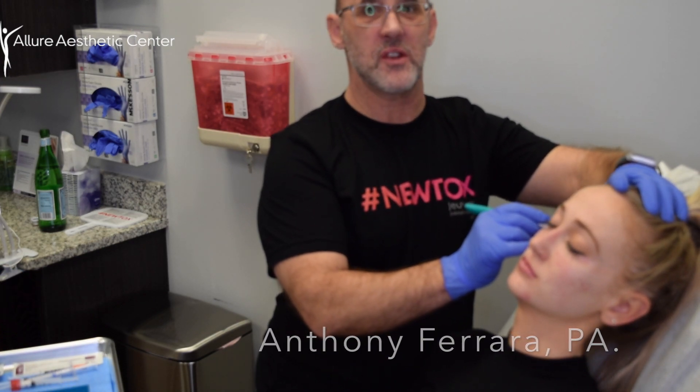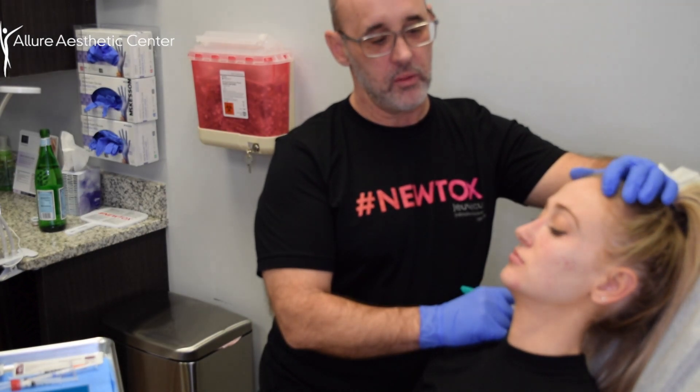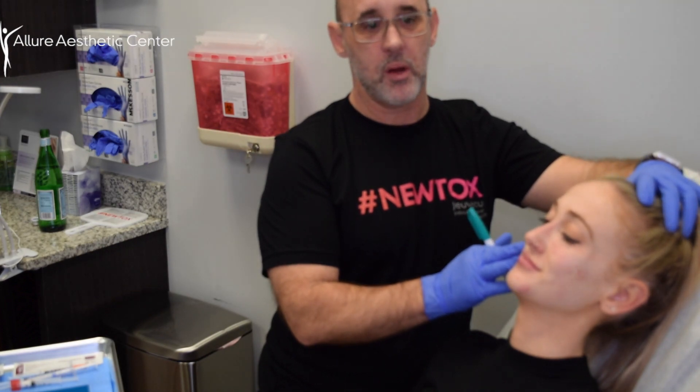Hey everybody, my name is Anthony Farrar. I'm a physician assistant. I've been doing aesthetics for about 10 years now, and today we're going to be doing a little bit of volume to my beautiful little model here.